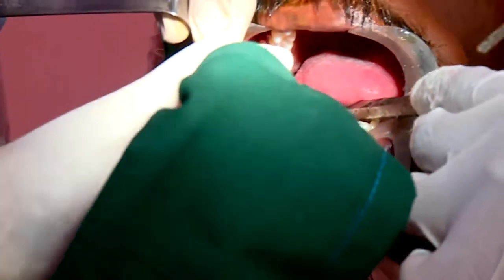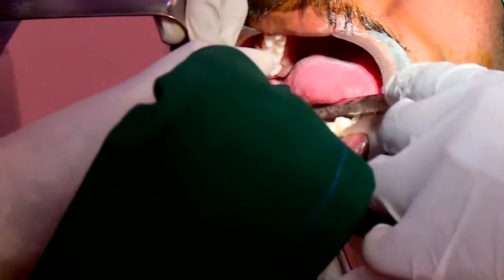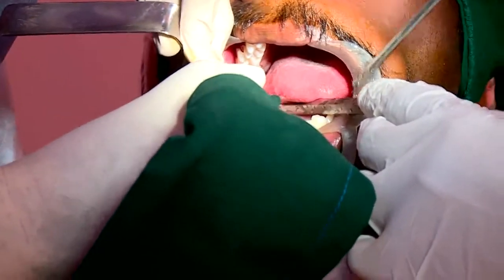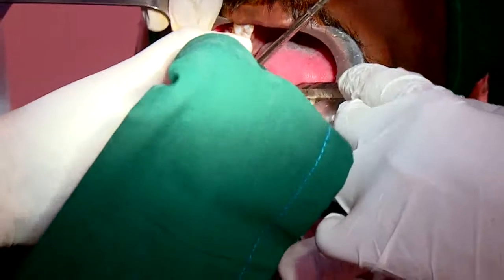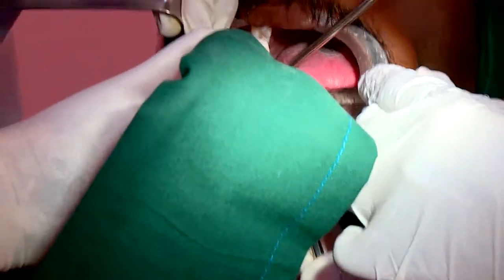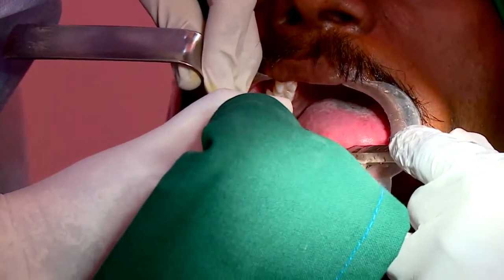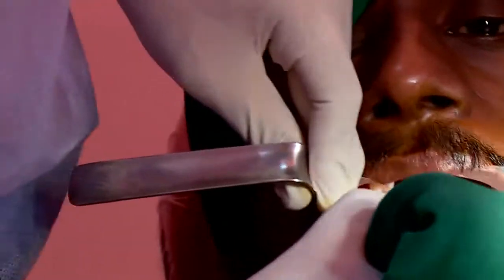You have to follow the course of the inferior alveolar nerve when you gutter on the buccal side, because it is usually shallow on the distal side. When it goes on the mesial side, it goes further deep. So it is very safe to make a minimal guttering on the distal side and more guttering on the mesial side, because your point of application for removal of a horizontal tooth mostly lies on the mesial aspect.